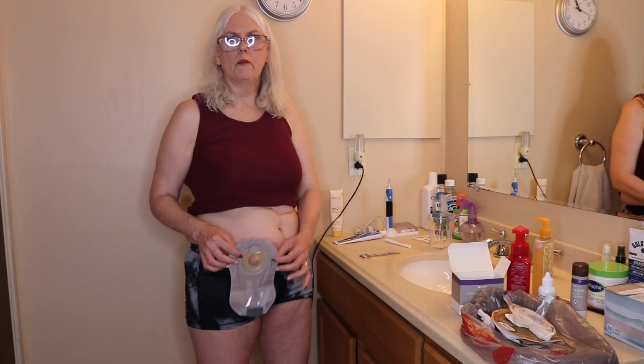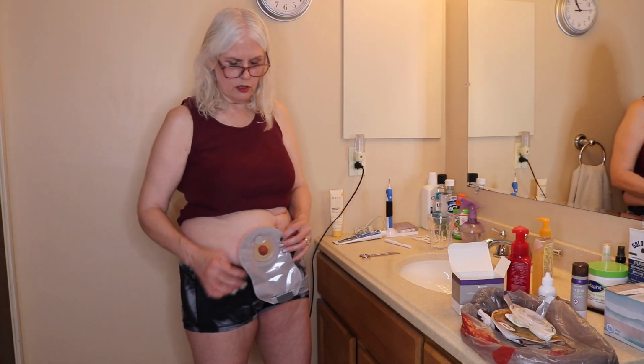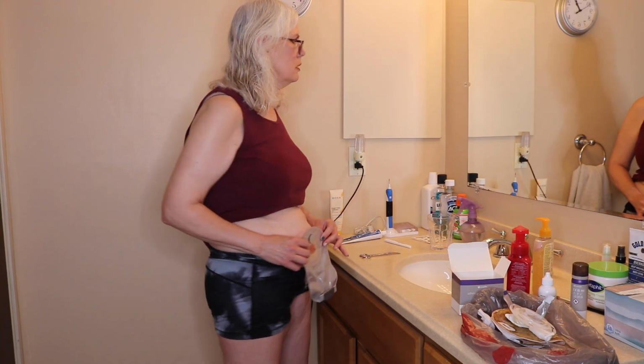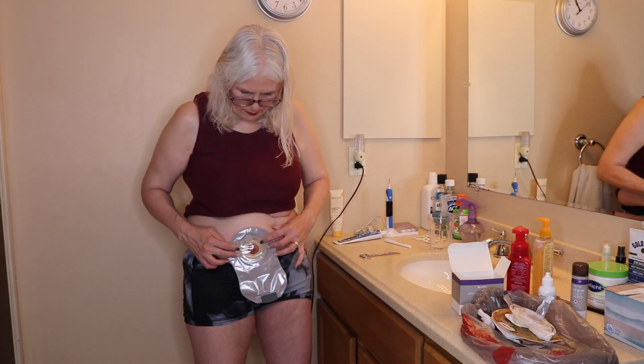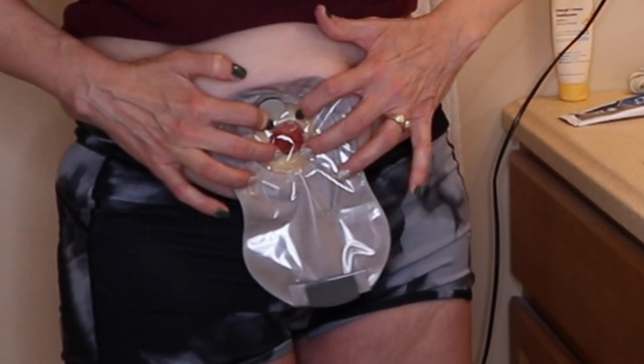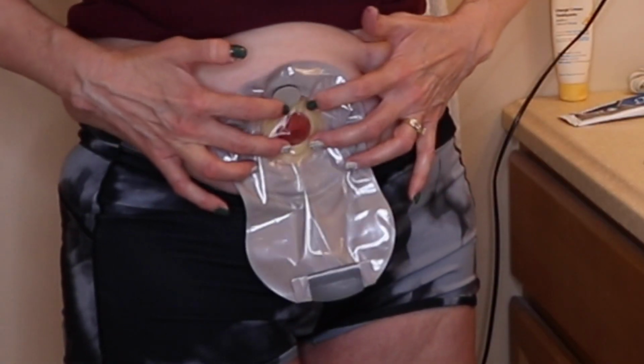And again, you can wear your bag straight, you can wear it sideways, whatever angle you want. I always like to have mine on an angle, so when I'm sitting on the toilet, it empties easier for me. So again, let me just use the mirror to get it on there. And then I press all around the stoma to make sure I've got a good seal all around there.